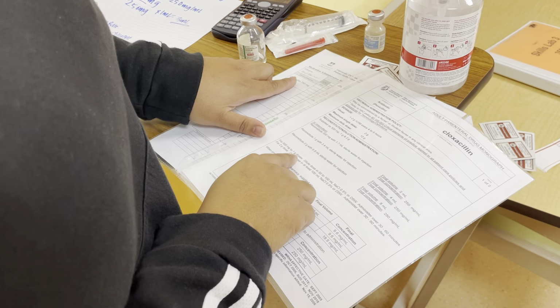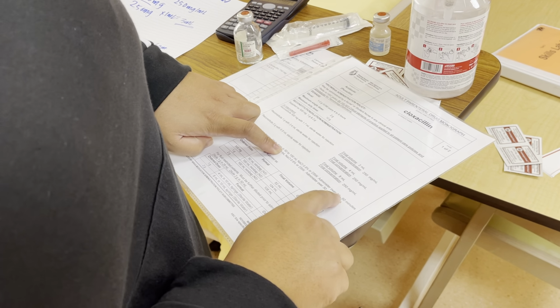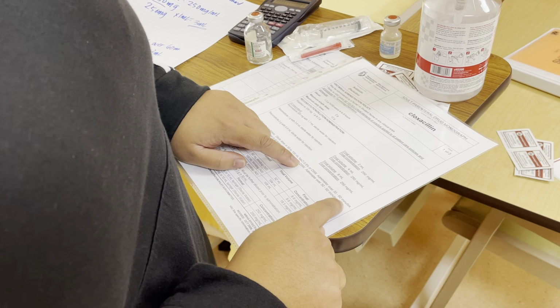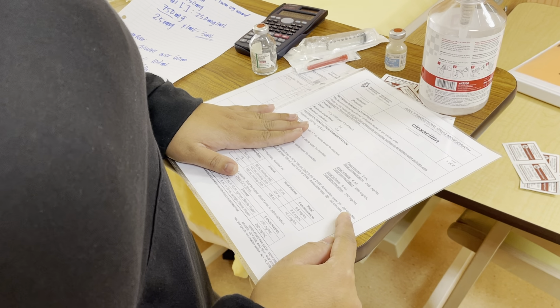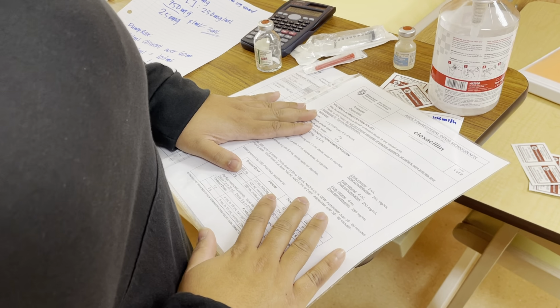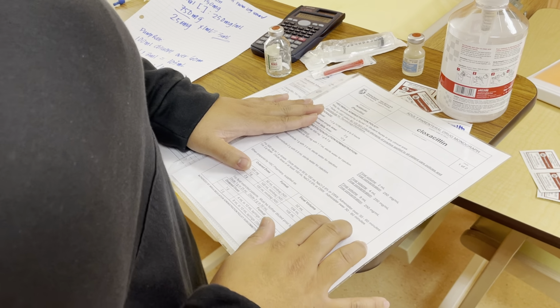And then for the 750 milligram dose, I'll dilute it in 50 to 100 ml normal saline or D5W and administer over 30 to 60 minutes. So I've chosen to dilute it in 100 ml of NaCl and administer it over 60 minutes, because some people can have an allergic reaction to Cloxacillin, which is a derivative from penicillin, and that allows me more time to correct or prevent any adverse reactions from happening, or should it happen.